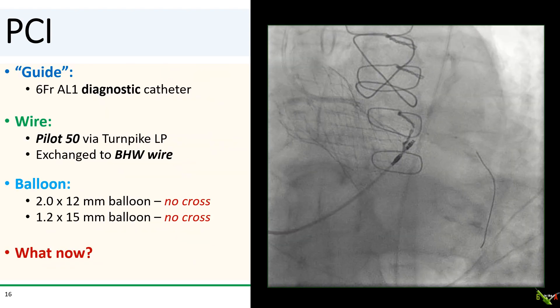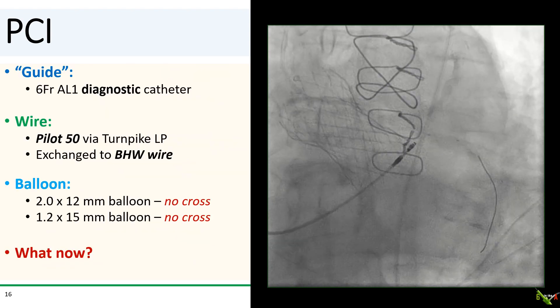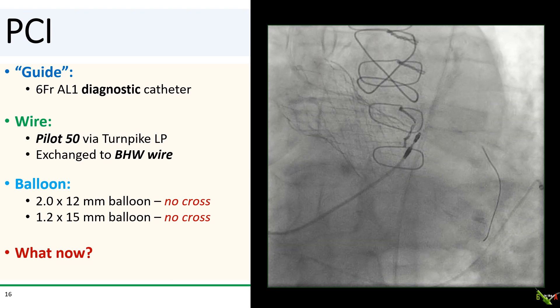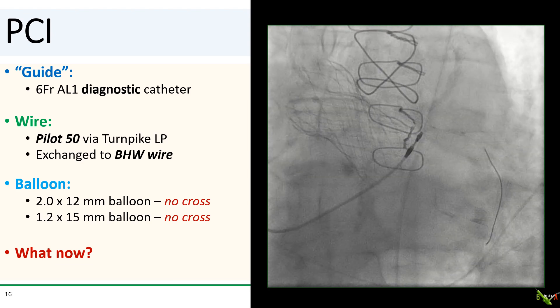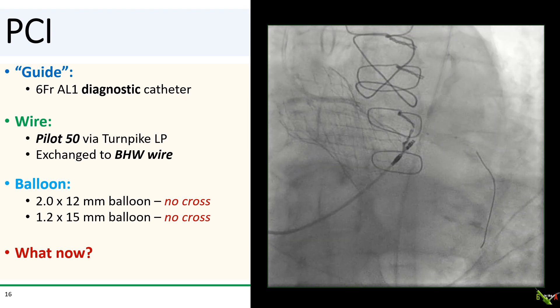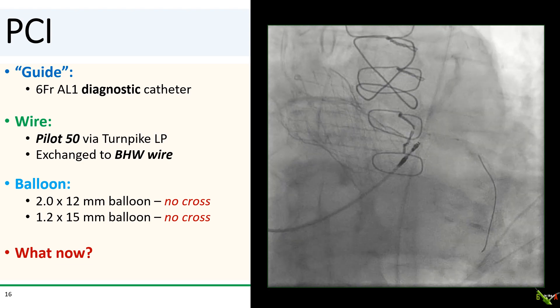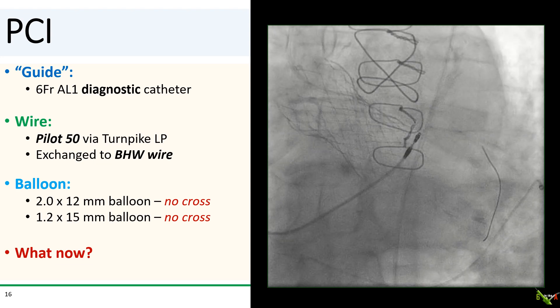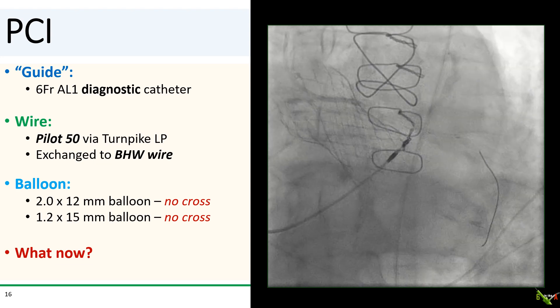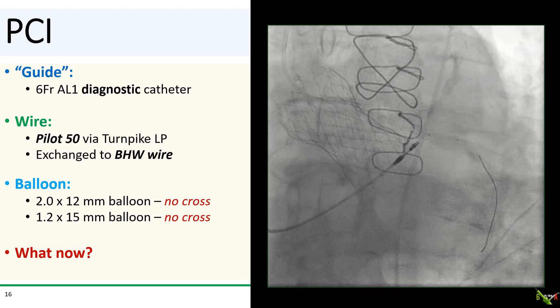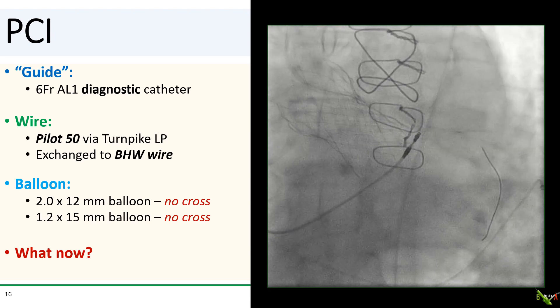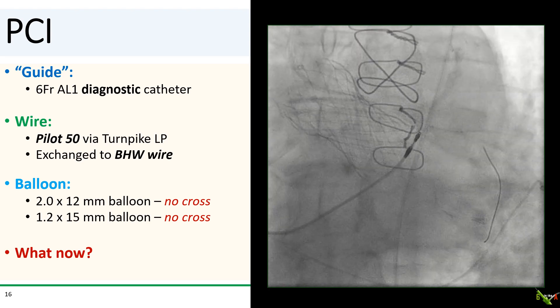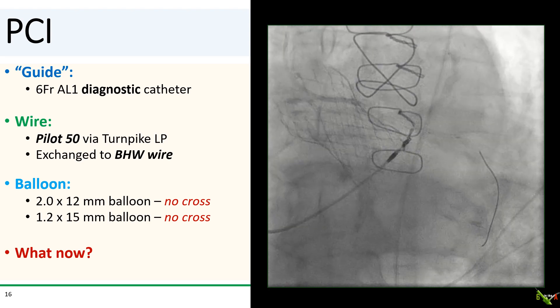Brimming with confidence, we went ahead and used our 6 French AL1 diagnostic catheter for PCI. The engagement was tenuous, but we were actually fairly easily able to pass a Pilot 50 wire to the distal circumflex via a Turnpike LP micro catheter. We then swapped the Pilot 50 out to a more supportive BHW wire.